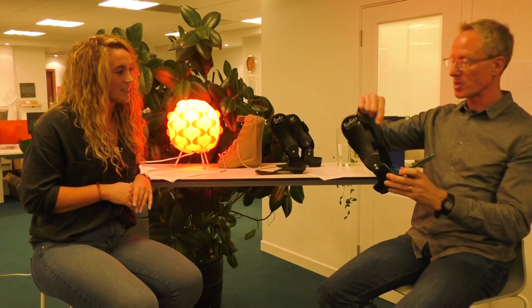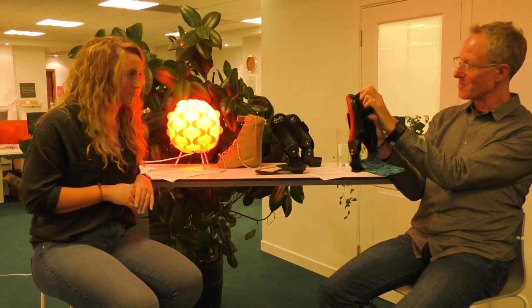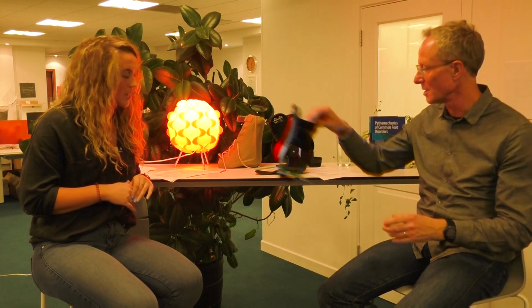Yeah, I remember. So there was no lateral upright, but the person then used a large Velcro band to adhere the medial upright, and that just helped stabilize this part of the foot and the midfoot to the leg, and that was better than the alternative, which was no product at all.